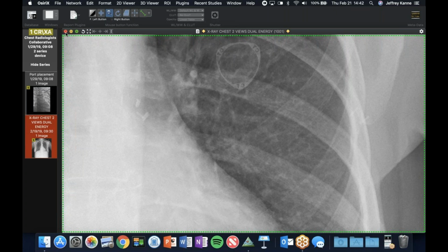I thought I was the only person who'd seen that before, and it was pointed out to me when I missed it by John Harley, who was placing these ports at the SCCA at that time after retiring from the VA after decades. He called me up and said, the reason they couldn't inject this port is because the thing has flipped over under the skin and the back is facing out now. They try to inject the back, it won't work. And I had never heard of such a thing. So I was very embarrassed by having not understood that and not anticipated it.